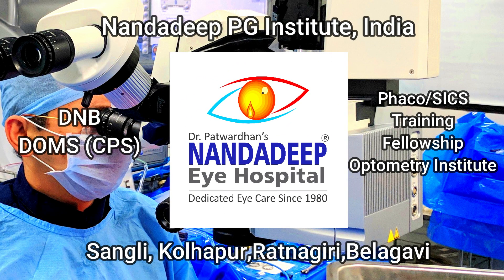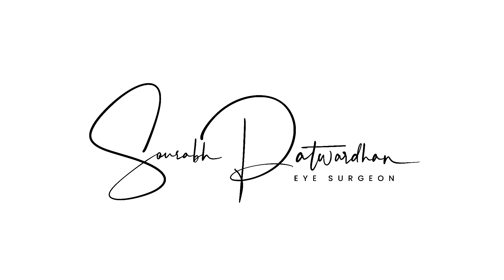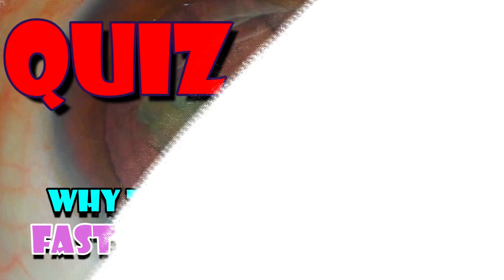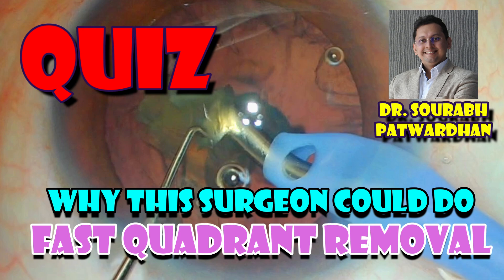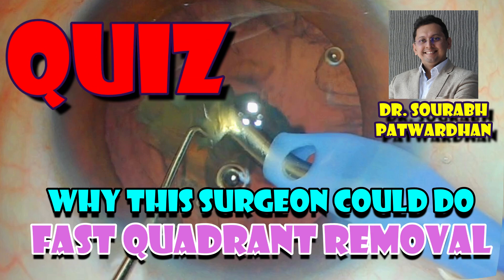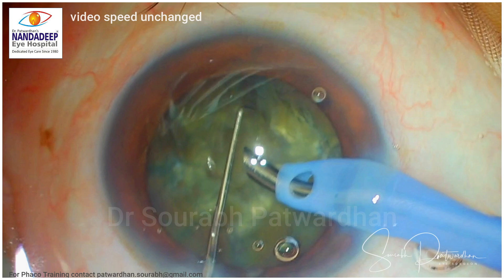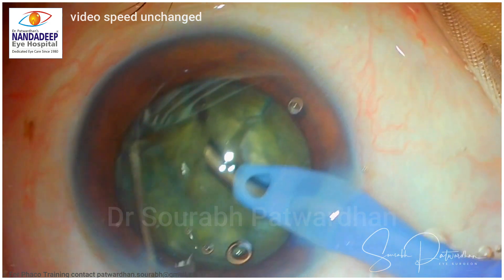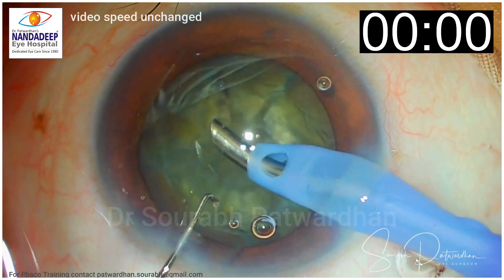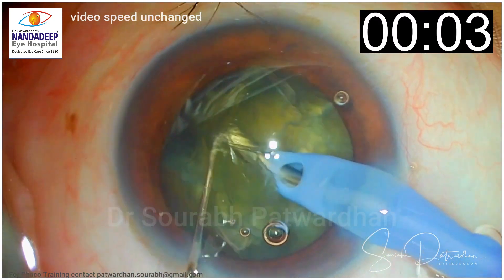This is another quiz video. I want you to see this short video, comment, and also analyze why this surgeon could do the quadrant removal in a very quick way, just within 30 seconds. I want you to analyze each and every step very carefully so that you can find out the reasons behind such an efficient quadrant removal.